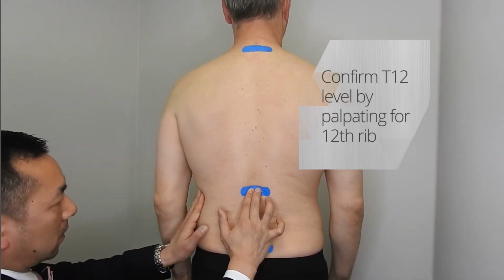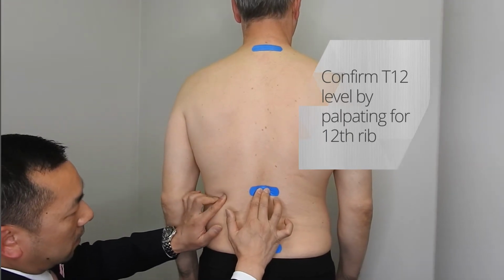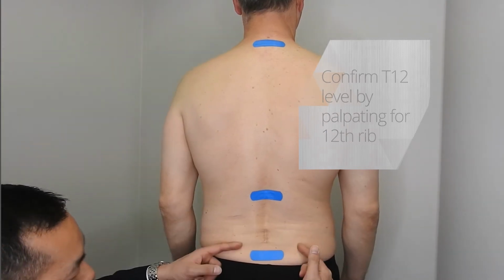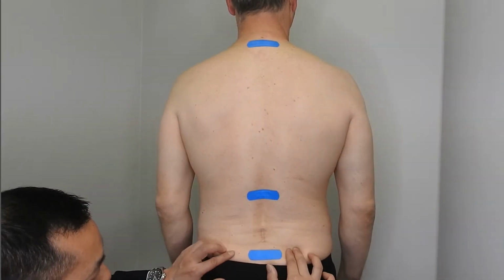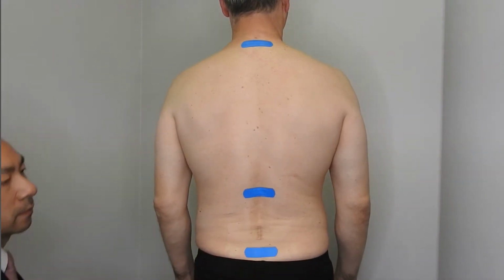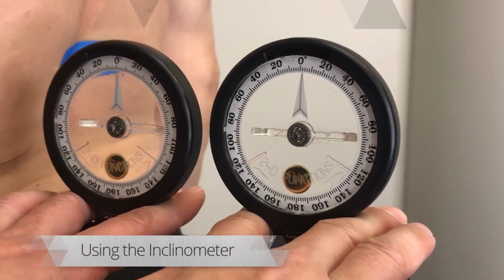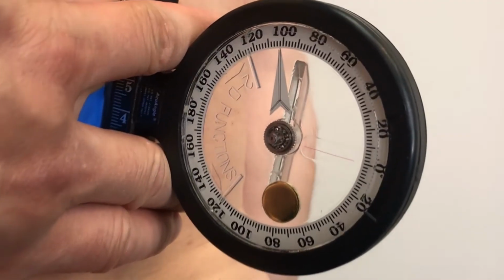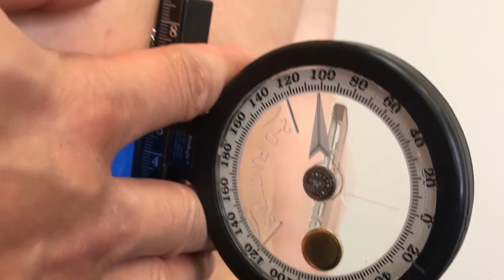Confirm this by palpating across from the floating 12th rib. Just below the dimples is the posterior superior iliac spine. In between is the S1 level. Mechanical inclinometers may be zeroed to vertical or horizontal gravity by turning the internal dial until it clicks.